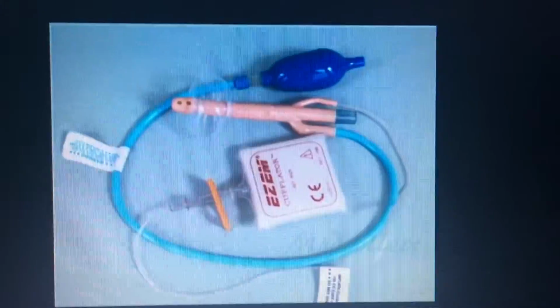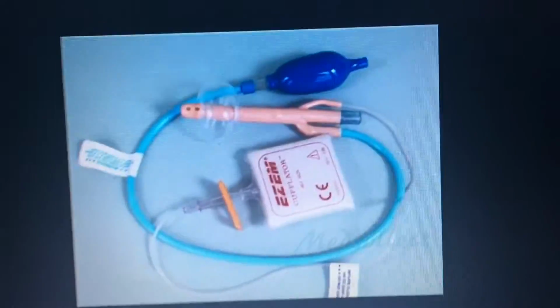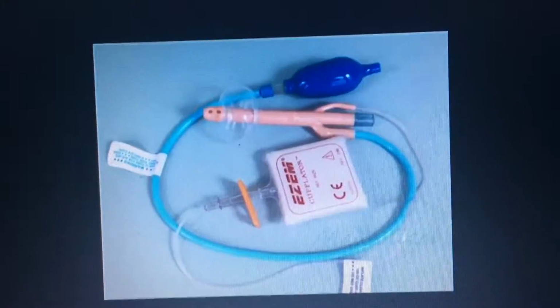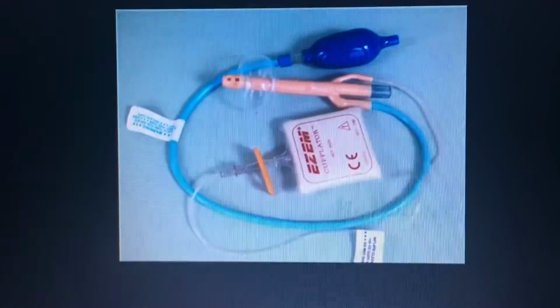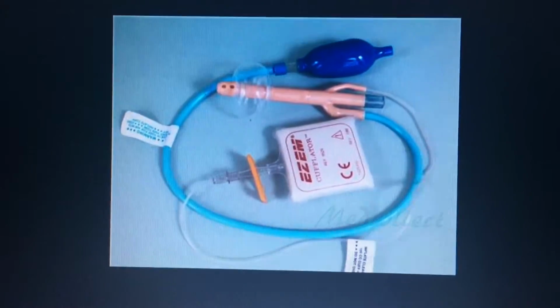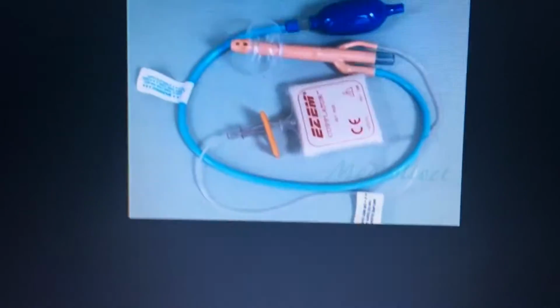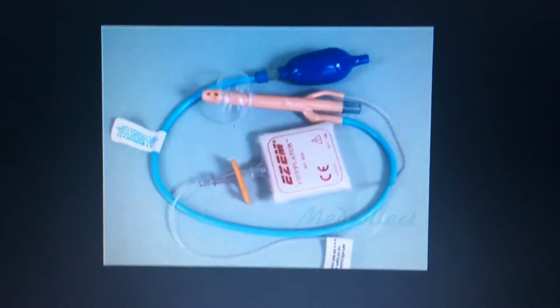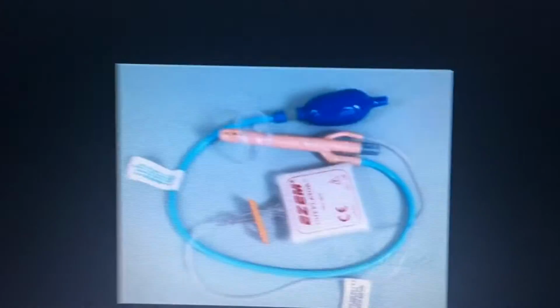Alright, so originally I had a video demonstrating how to insert the barium enema tip, no further than 4 inches, anterior, superior, but I erased my 7 minutes introducing myself to the patient, patient interaction, patient history, and the actual tipping and the scout image.